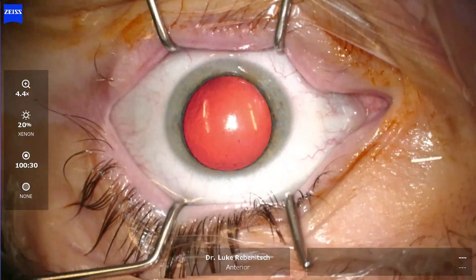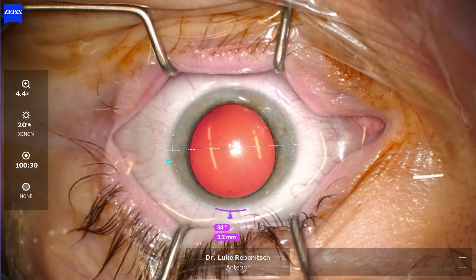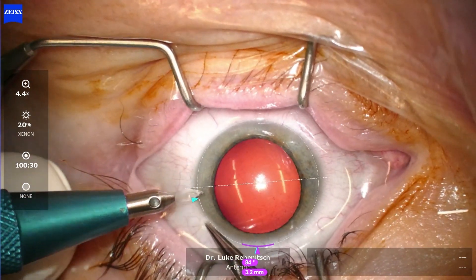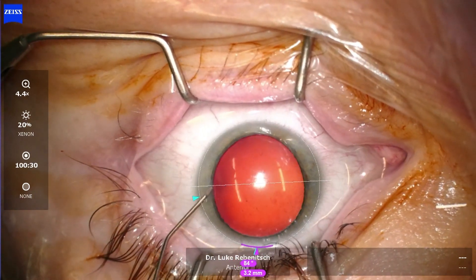Now we go back to the patient. The first thing we're going to do is make a very small opening, about 1 mm to the side. This is where we place initial medication, numbing medication, as well as OVD — that jelly-like substance — to make sure that the eye remains inflated and protected during this Evo ICL procedure.